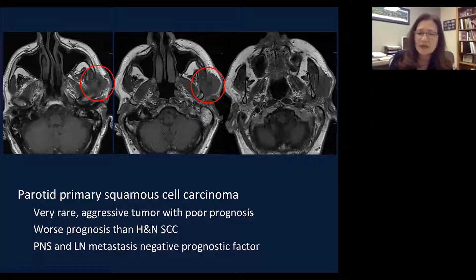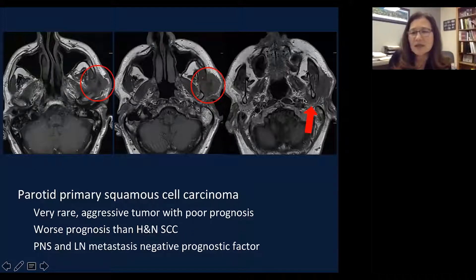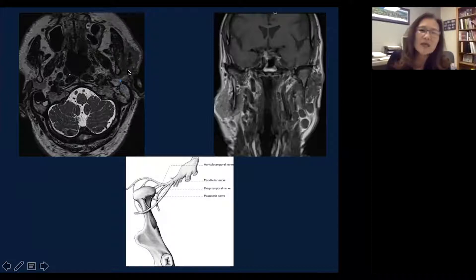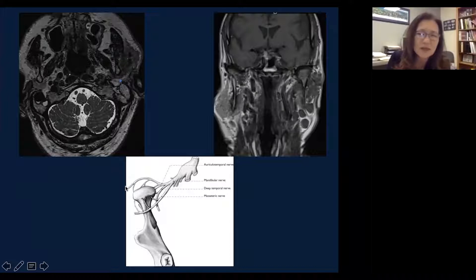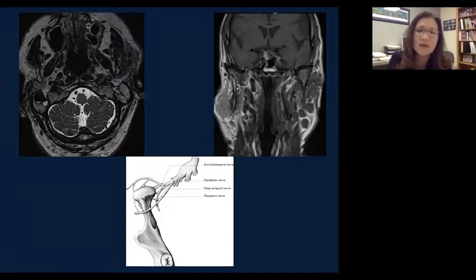Perineural spread and lymph node metastasis are also negative prognostic factors. The mass is not only invading the superficial parotid and masticator muscle, but it arches around posteriorly to the retromandibular space — this is an indication of tumor spread along the auriculotemporal nerve, which is a branch of the trigeminal nerve. This is a conduit between the facial nerve and the trigeminal nerve, and these findings are indicative of perineural spread along the auriculotemporal nerve.